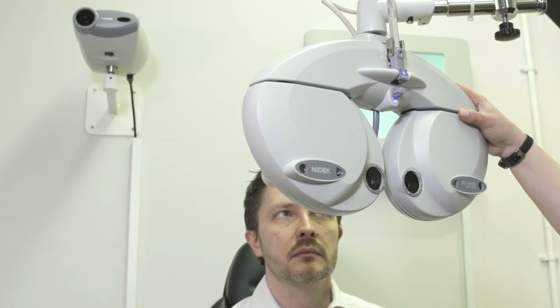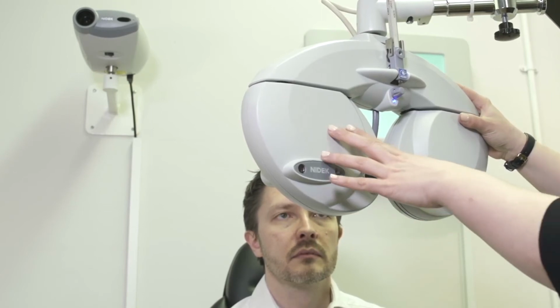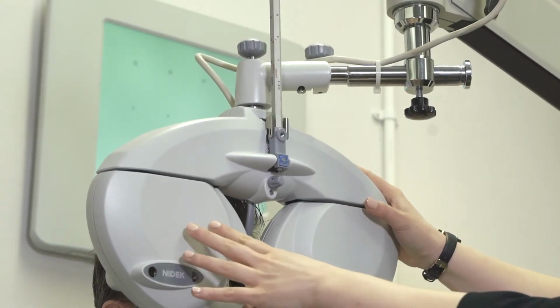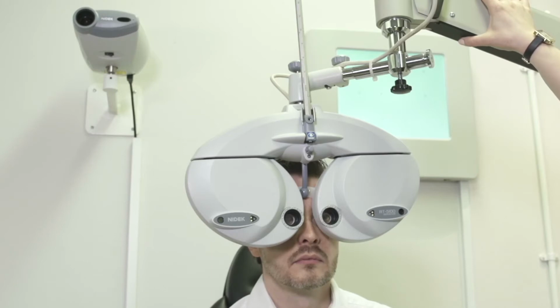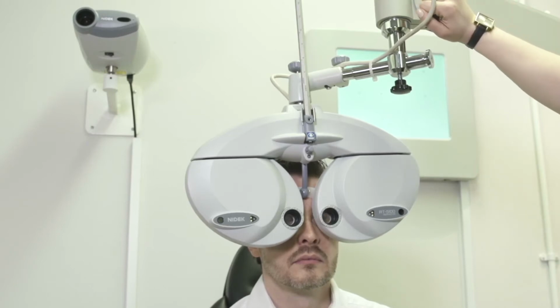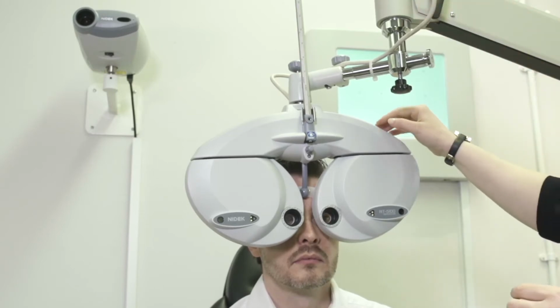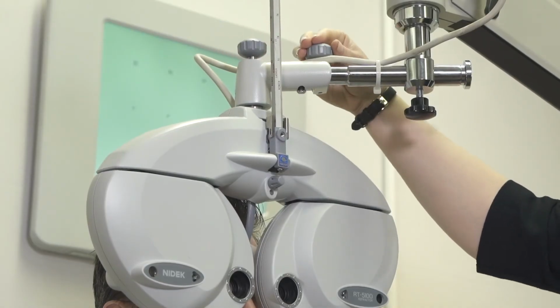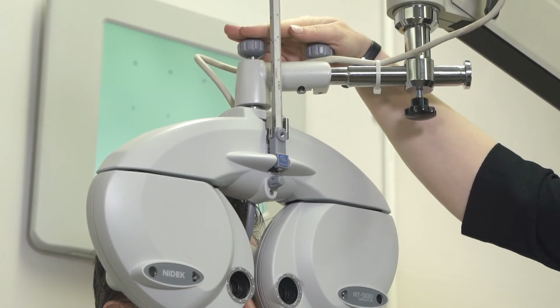So the RT 5100 is fully adjustable to get it as comfortable as possible for your patients. To line up, push the machine towards the patient, adjusting the height as needed using the arm here and securing that in place using the lock. We're able to adjust the tilt of the device both side to side and forward and backwards using the 2 grey knobs at the top.